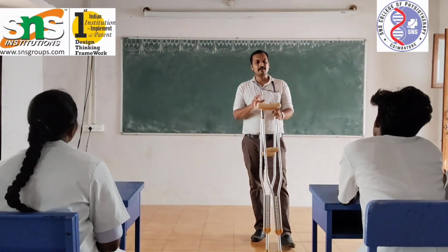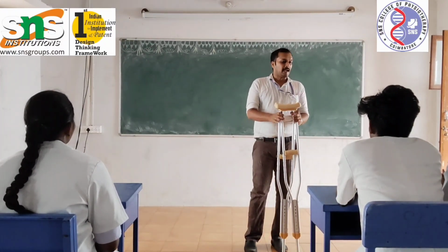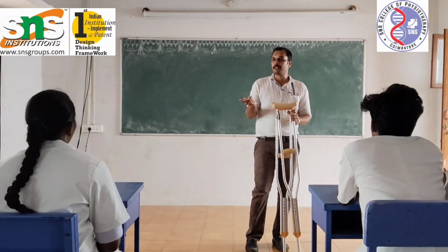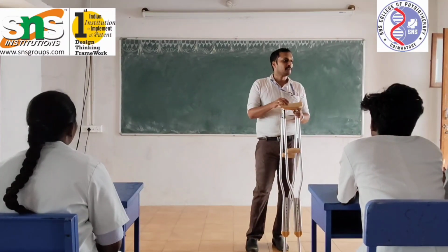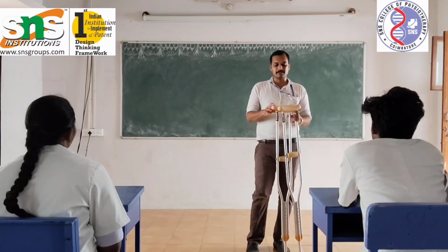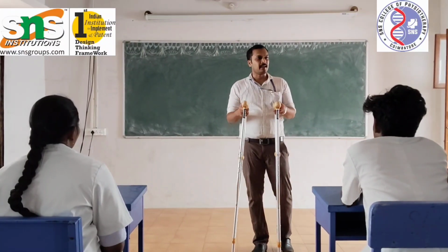For example, in crutches itself, what are the different types of crutches? Axillary crutch, elbow crutch, and then the gutter crutch. Yes or no? So today we will see about the axillary crutch. So this type of crutch is called the axillary crutch.